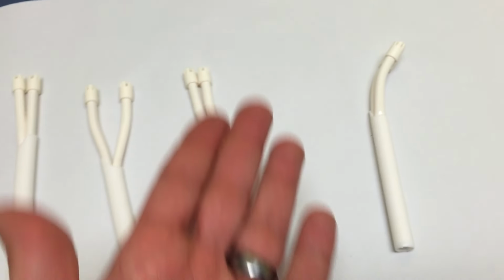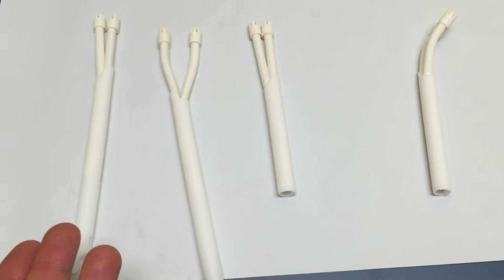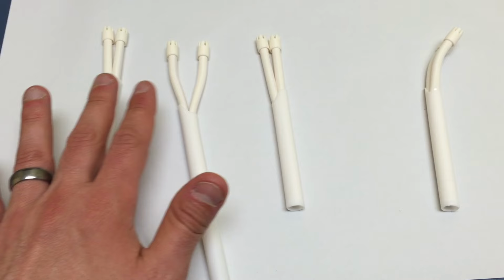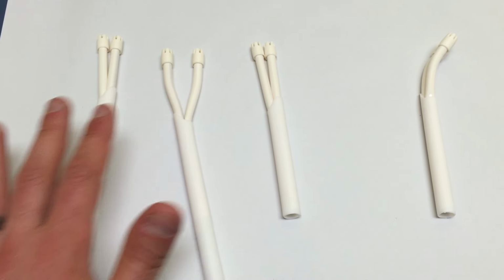So there you go. It's basically 15 cents with parts you already have around the office, and you're going to get excellent retraction and suction, and pretty damn good lower quadrant isolation.